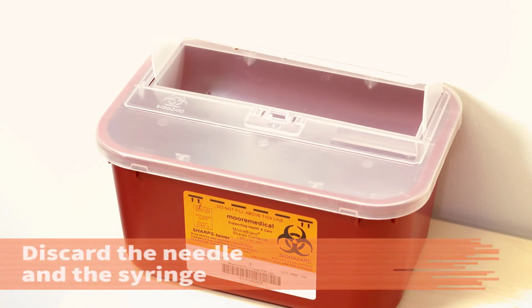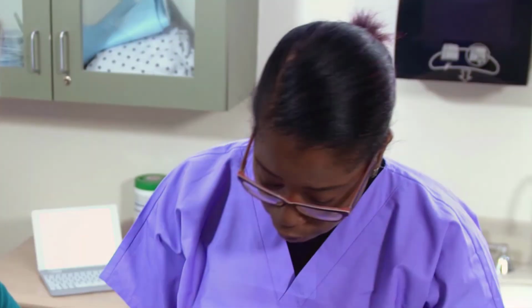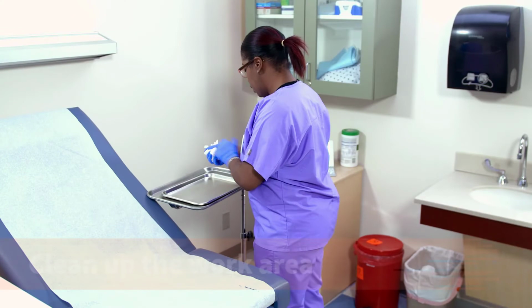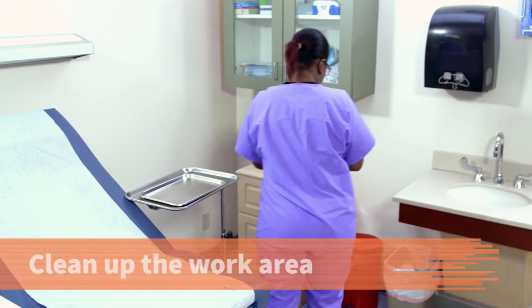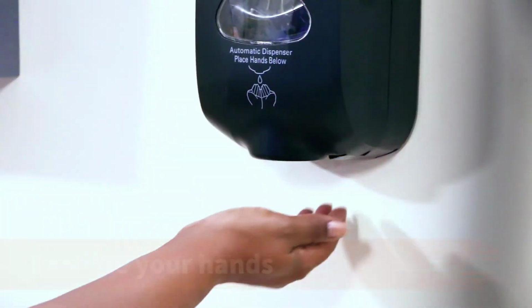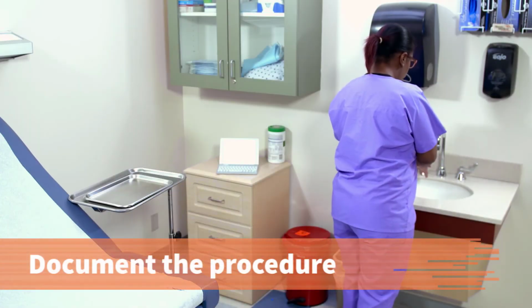Some people may be allergic to the adhesive. Discard the needle and syringe in a biohazard sharps container. Make sure to put the needle in first. Observe the patient for any adverse reactions. Clean up the area. Discard all waste, including your gloves, in the biohazard waste container. Sanitize your hands. Document the procedure in the health record.